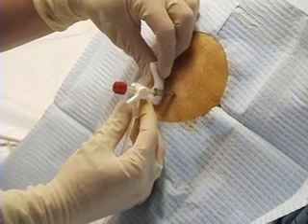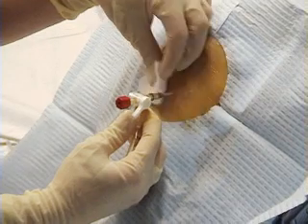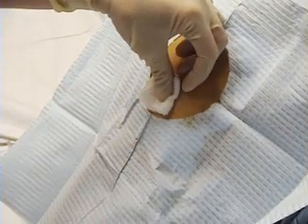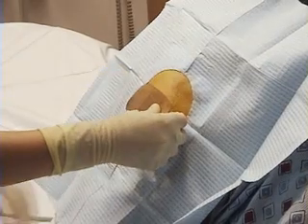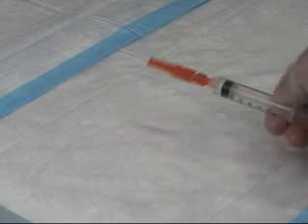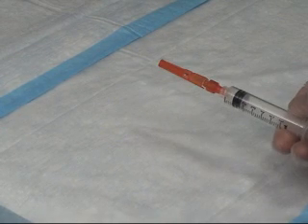On completion of fluid collection, you should rapidly remove the catheter as the patient holds his or her breath at end expiration. Cover the needle insertion site with an occlusive dressing and clean the surrounding skin. At the end of the procedure, make sure that all needles are placed into appropriate safety devices.